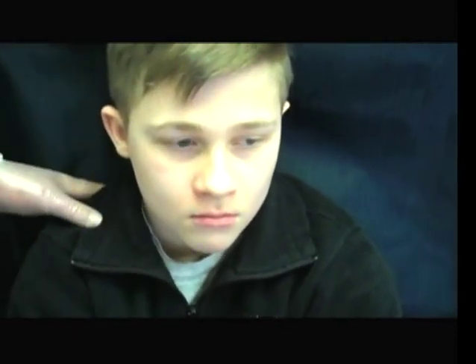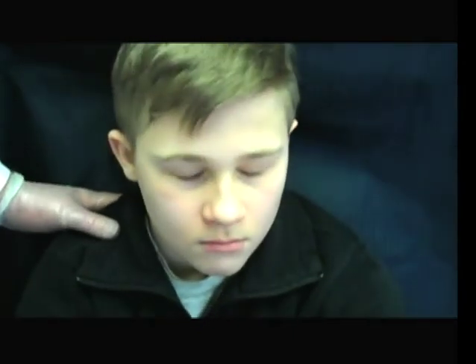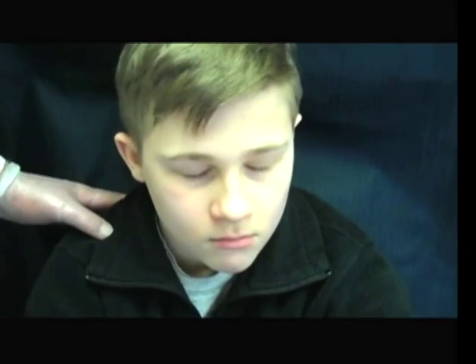And he's doing quite well. You can see he's lost all that discoloration around his lips, and his head movements have diminished greatly. In fact, they've ceased as he sits here in the chair, and this boy is responding very well, as he should. It actually helped me really well when I just came in here. I was ticking a lot more, and then when this got built up, I just really relaxed a lot more.